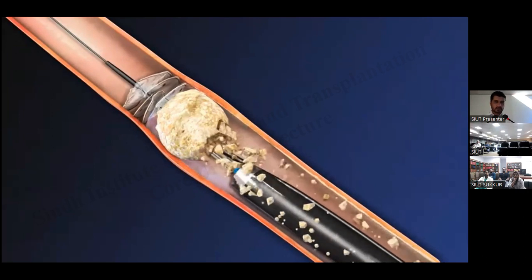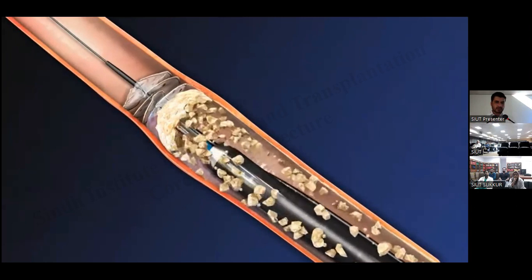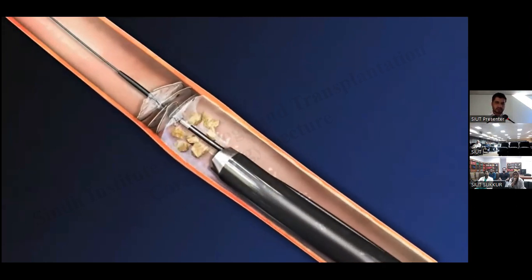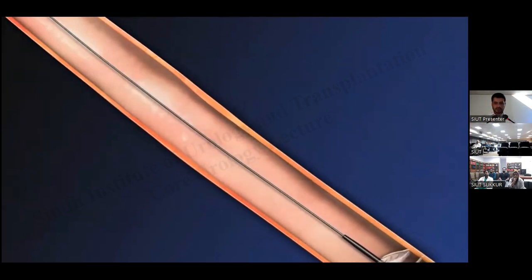First, the occluding device is placed proximal to the stone, and then the stone is fragmented, and after that, the stone is extracted through the ureter.